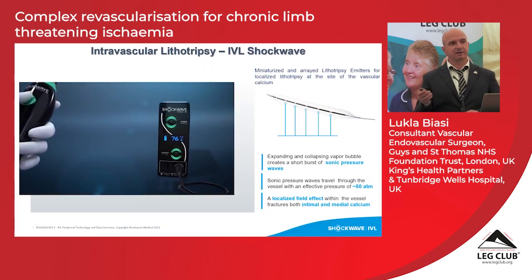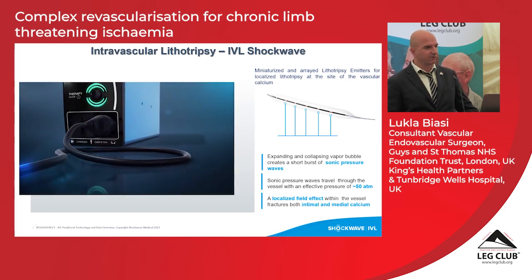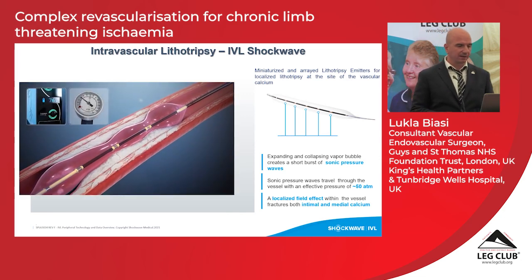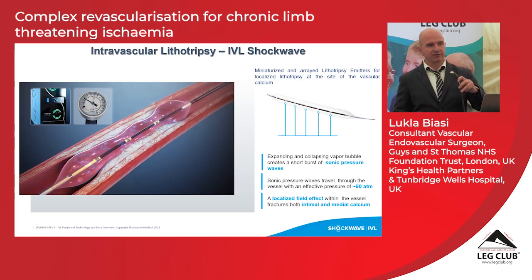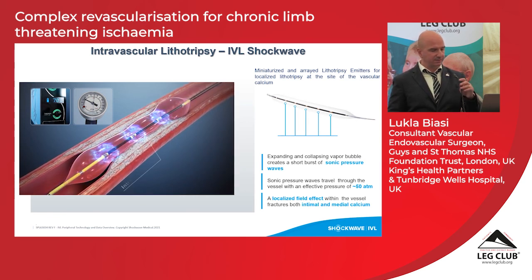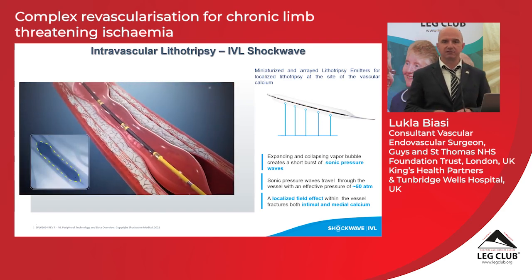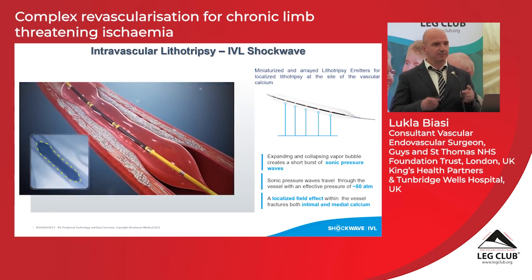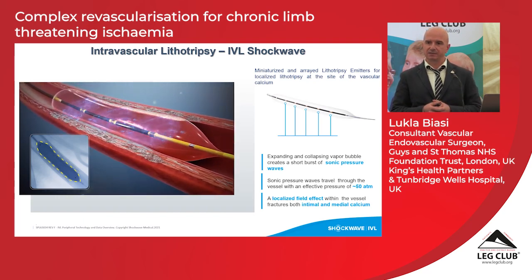And that's the second kind of breakthrough technology. It's called shockwave intravascular lithotripsy. And we at St. Thomas's have been the first center in Europe to use it in the tibial arteries, and probably one of the biggest centers still now for all the circulation. The concept, again, is revolutionary. It's the same technology that you may have heard for kidney stones, okay?